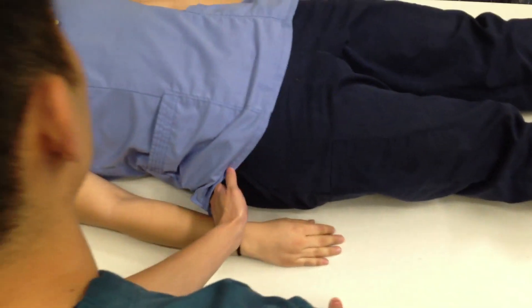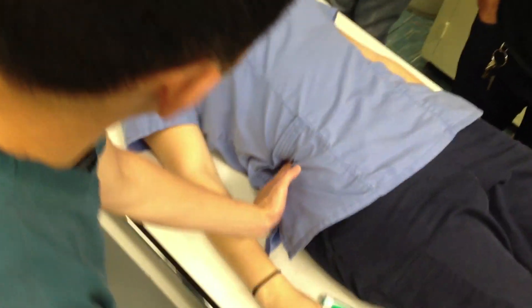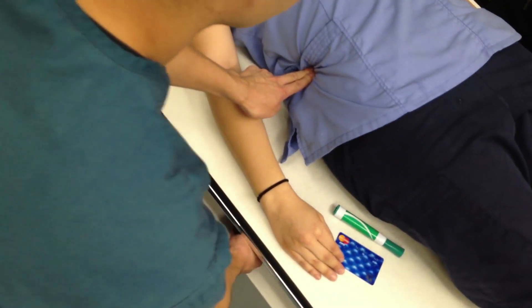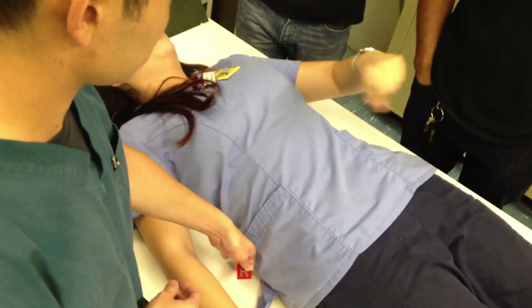So basically you can just scoop for the hip right here. The crest is right here — two inches above, so like this. Can you invert your feet for me? And if this is hard for your patient to do — like elderly patients — sometimes they can't really keep their legs inverted. You can tape them.